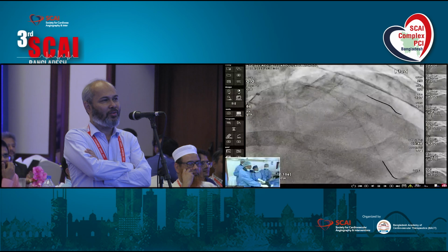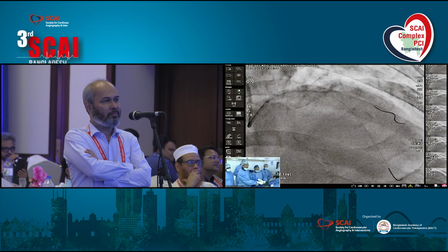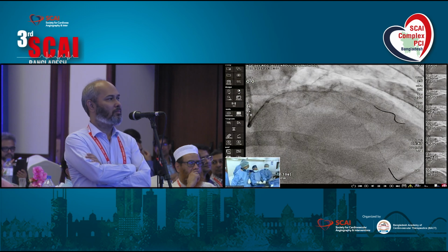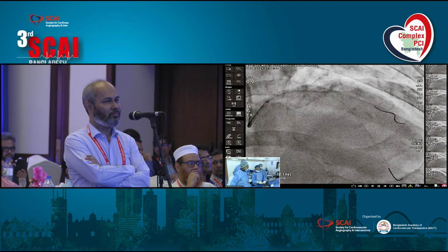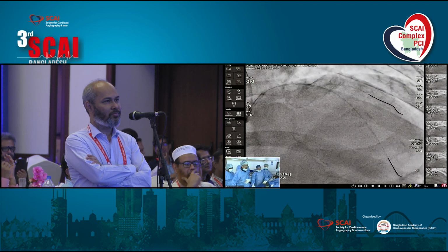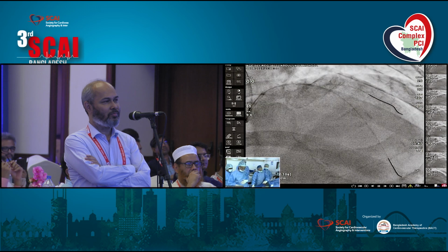And the vessel should be covered. Dr. Mir Jamaluddin, you have drug-eluting balloons. Would you want to do a DEB here instead? But it's very fibrotic, you know? I don't think so, unless you do a cutting balloon. No, if I also use DCB here, it will recoil and we will not get the effective result. And that is why I like to put a stent here.